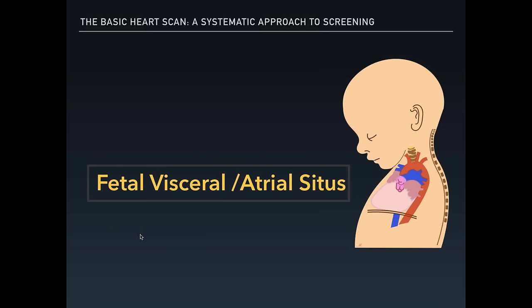The first step to the sonographic evaluation of the fetal heart is the assessment of fetal situs. First, let's take a look at the big picture and then work our way in.